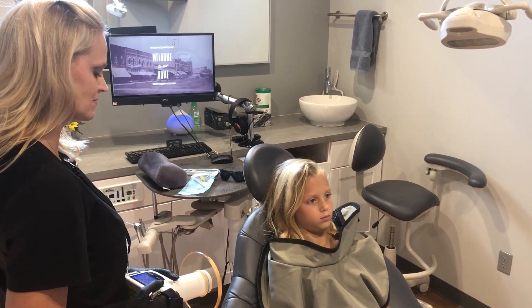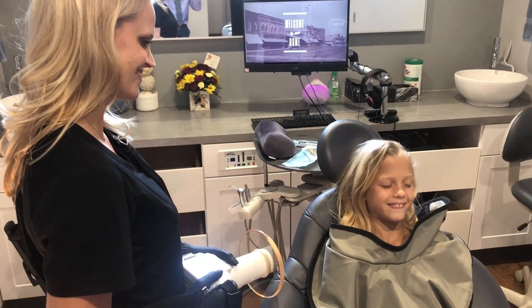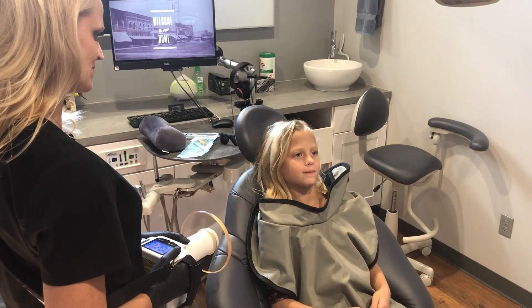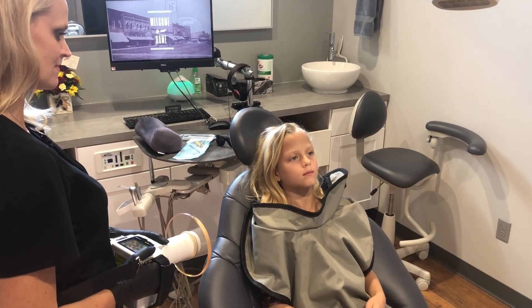Hello everyone, we're going to do a quick training video on the XTG handheld x-ray. We have Brooke and Miss Kayla here. We're training on the XTG x-ray, and Brooke's going to do a quick little series just to show you some positioning with the handheld x-ray on a bite wing.